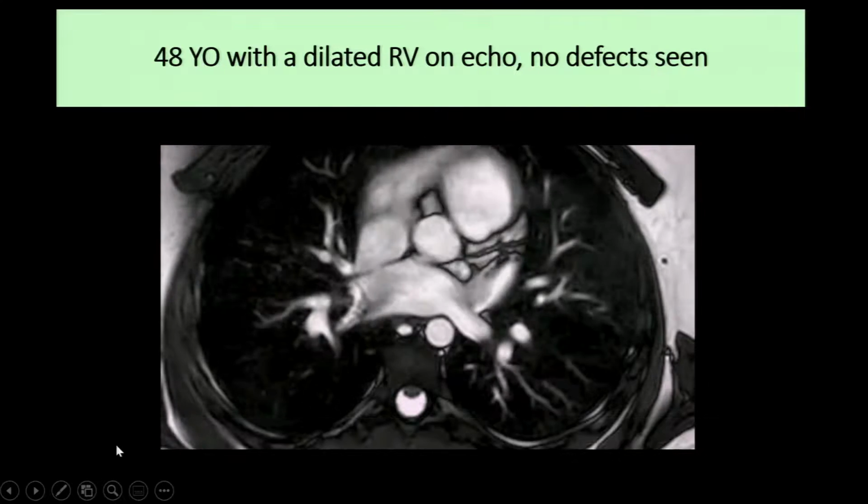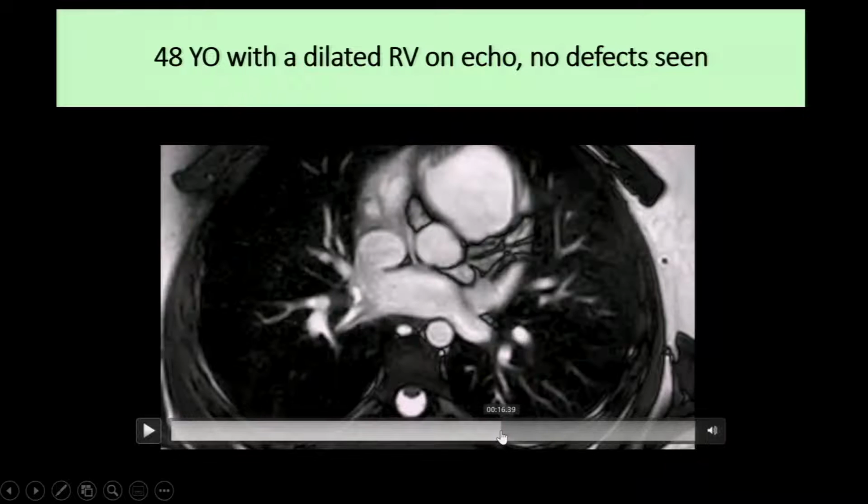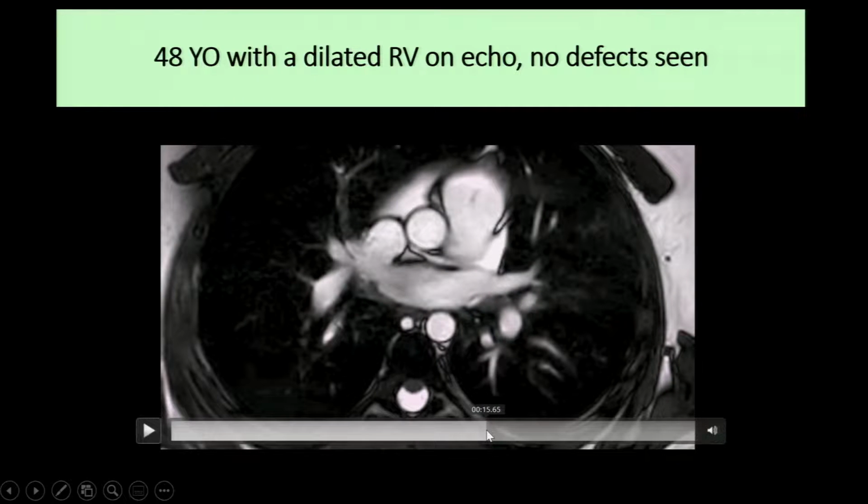And then we can see here, and I'll just slow down for clarity, that as the pulmonary vein courses towards the left atrium, there is an area of overlap between the posterior wall of the superior vena cava and the anterior wall, if you will, of the right upper pulmonary vein, and that area is here missing.